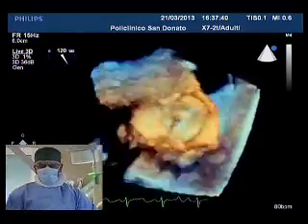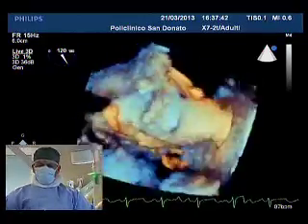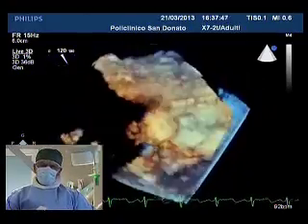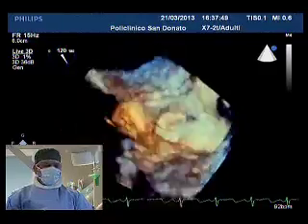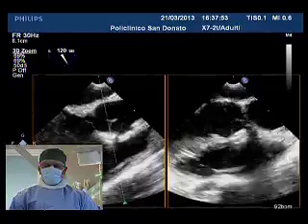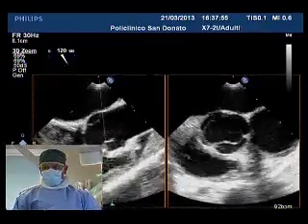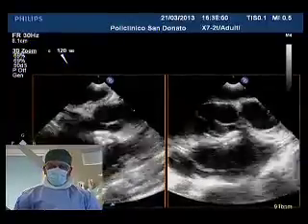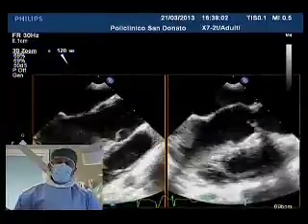So, as you know, I travel a lot, and when I travel outside the US, because the device is still available outside the US, if I have the right patient, older than about 2 to 3 years of age, I do not have any problem using this device. The incidence of heart block is extremely rare. Now, would I use ADO2 in this case? Yes, you can.